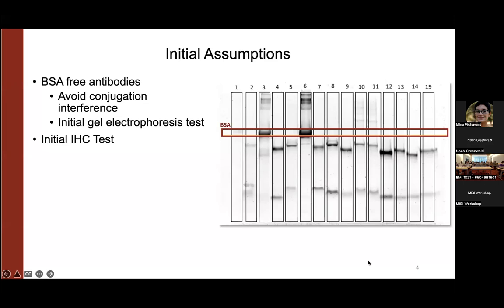So when you get your antibody, check that the antibody is working, and that you didn't go straight from ordering an antibody to conjugation in MIBI, and it's not showing anything, and there was never an initial IHC done. These are a couple things that we do in our lab ahead of time, and this might address a couple issues that might happen. From there, we'll be looking at troubleshooting any additional issues.